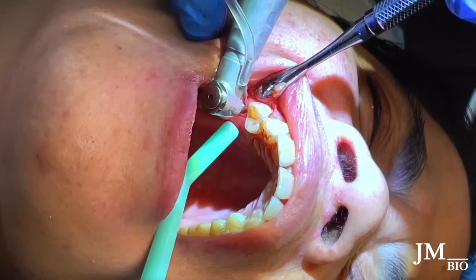Most single placement cases don't take very long once you've done a lot — you tend to move pretty quickly. I go step by step to the next drill down to depth. I don't keep the drill in there for very long; it's just in and out.